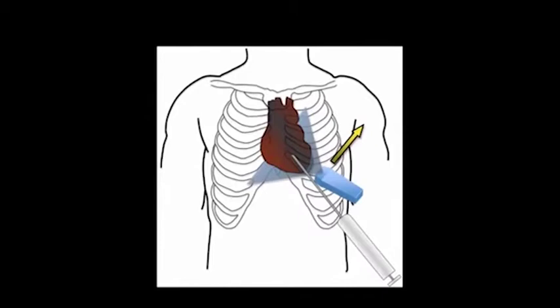In addition to the subcostal window, you can also use the apical 4-chamber window. For this particular window, I'll again place the needle just lateral to the probe. However, this time I'm going to come from a medial orientation directed towards the apex of the heart. I'll again be able to see virtually the same thing that we saw with the last image. However, we'll of course use the phased array probe in this instance because it's much easier to visualize through the rib spaces with a phased array probe rather than with a curved linear.